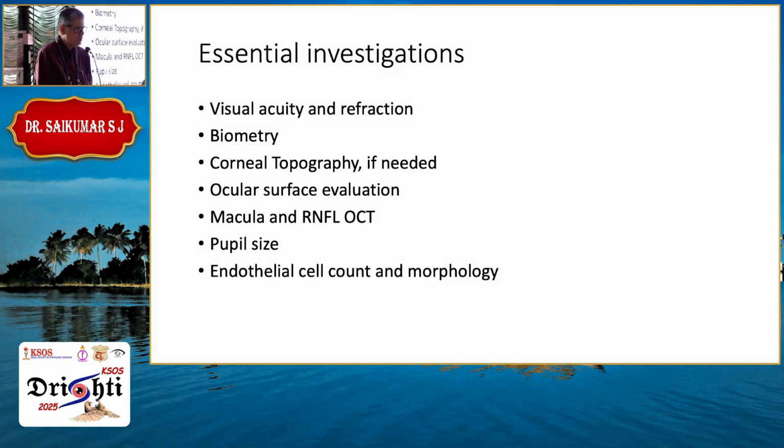Surface evaluation: always do a macular OCT in these patients. Don't think it's an unnecessary investigation. If you're going in for one of these premium lenses, always do a macular OCT. In many cases, we pick up very subtle lamellar holes and small epiretinal membranes, which are not visible on your clinical examination.